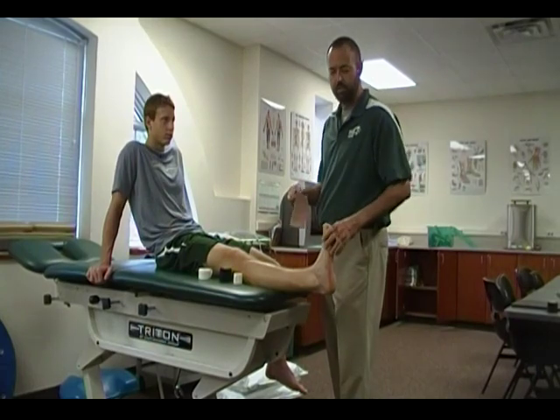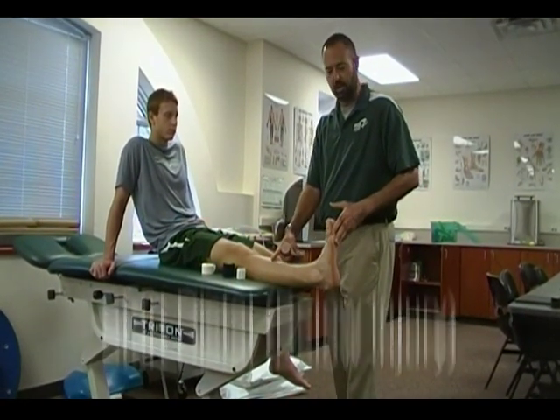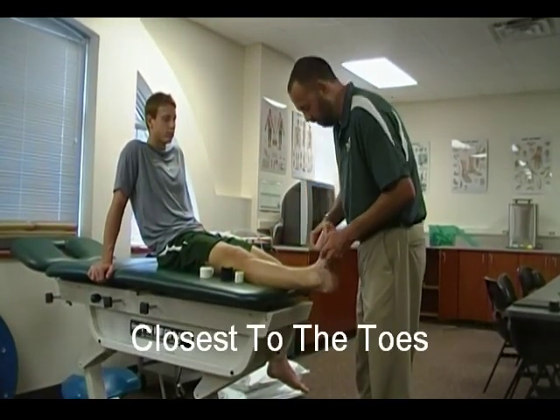Whenever you're applying for an acute injury to minimize swelling, we always want to start distal and work proximal. I'm going to begin at the base of the foot, nearest to the toes.